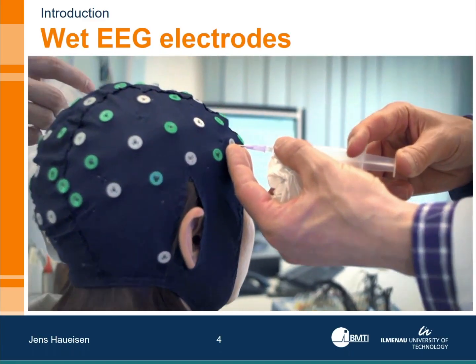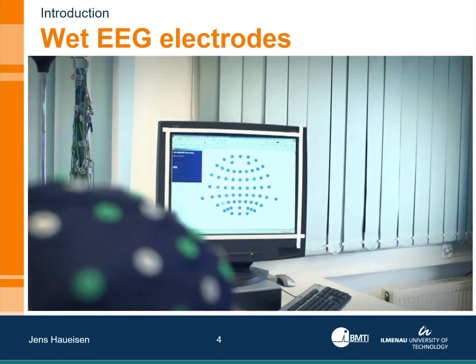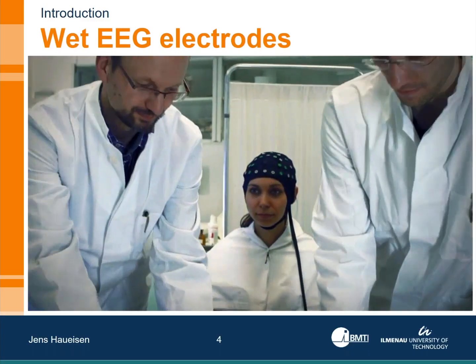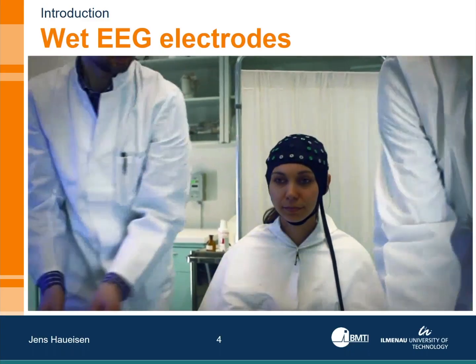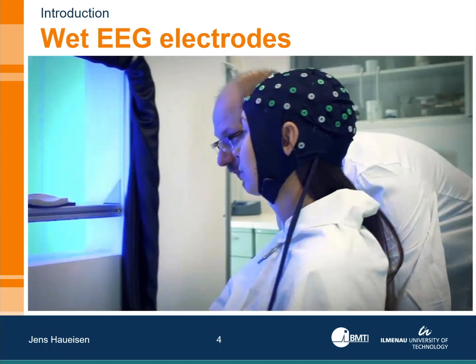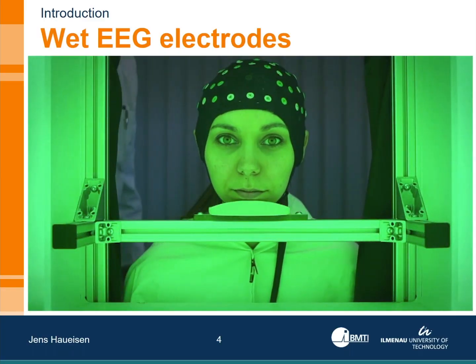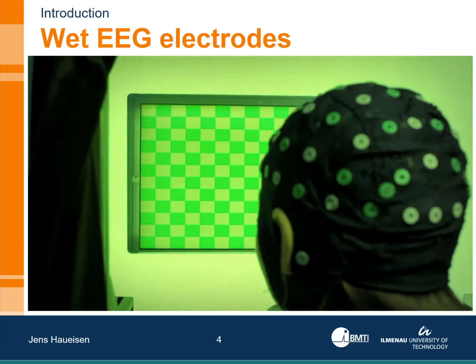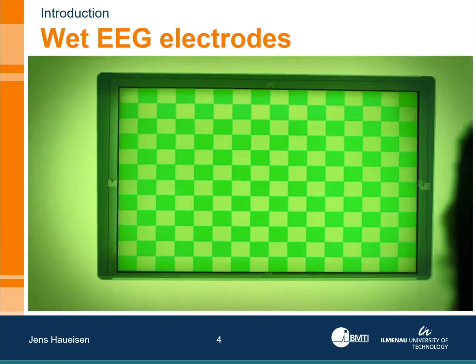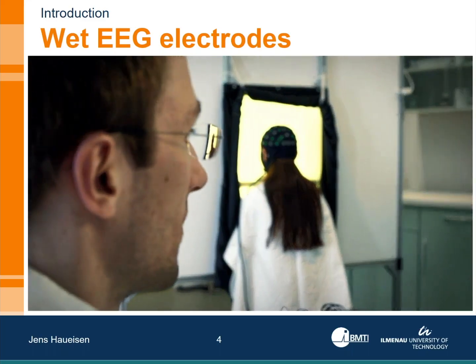And that is not the only drawback. The second drawback, besides the long preparation time, is that you need skilled personnel for that, and you are not really able to do this outside the lab. So whatever type of experiment you're planning, be it like in this case a visual evoked potential study or something else, you are bound to the lab or a clinic or similar.